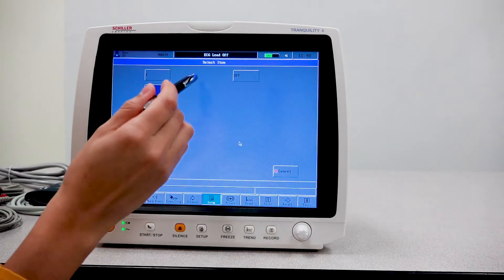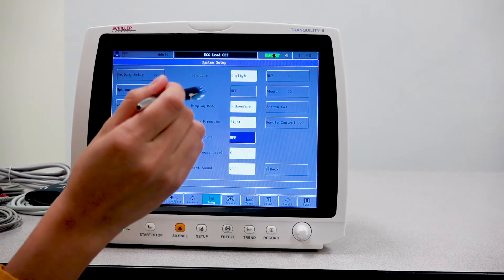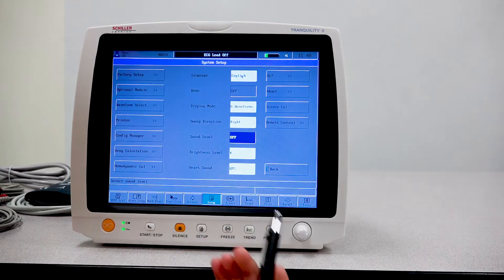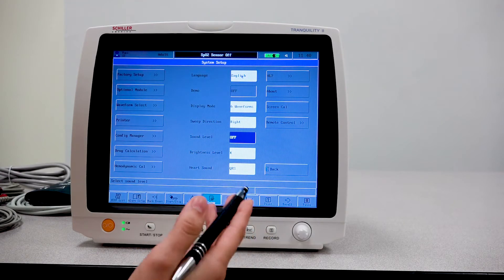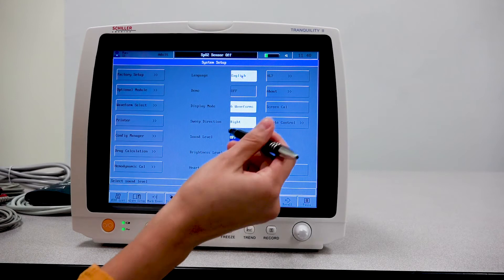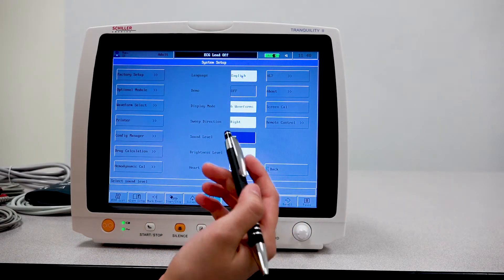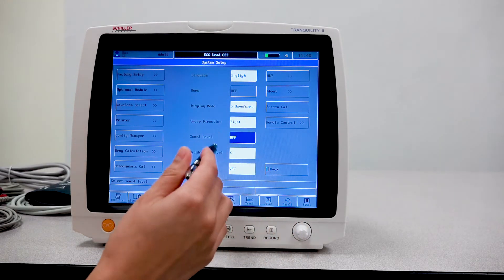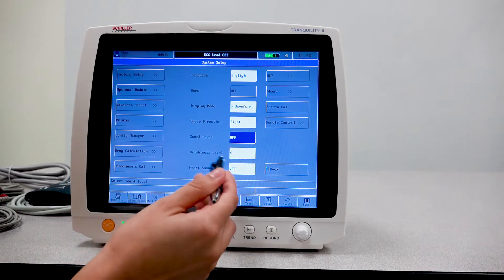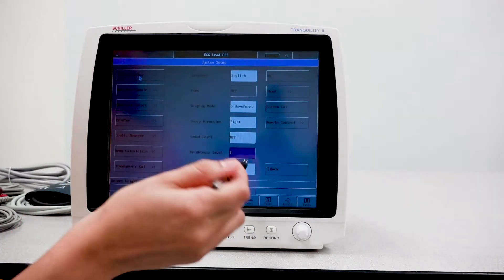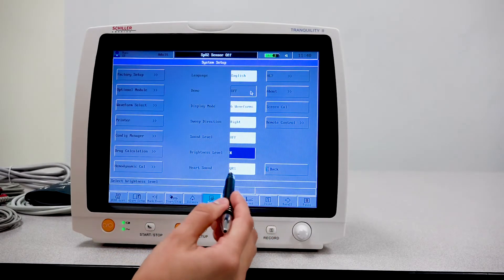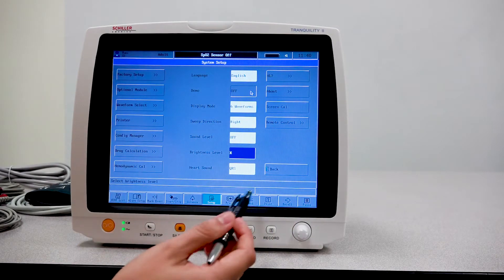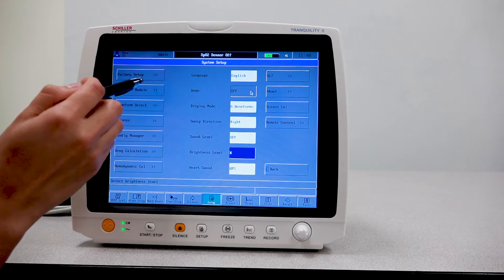Now be mindful, if you do have this off, you will not hear any alarms that go off. So please be mindful of that so that we can enable any alarms that we need to have enabled. And then you have your brightness level that you can select from least brightest to the most brightest.